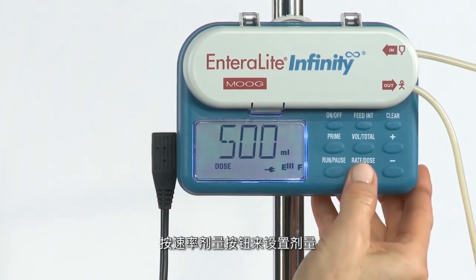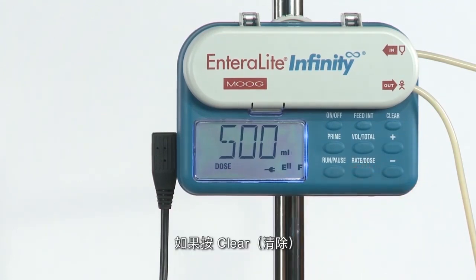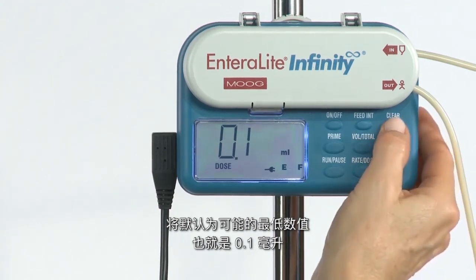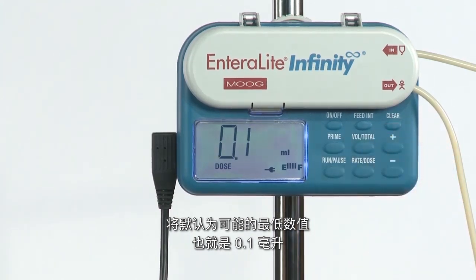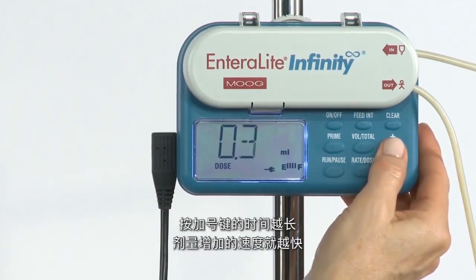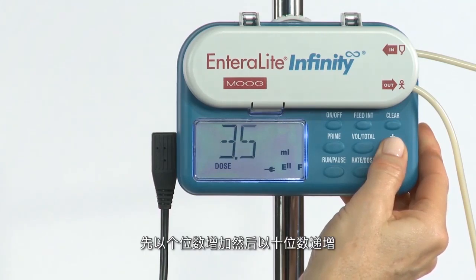Press the rate dose button to set the dose. If clear is pressed, it will default to the lowest possible value, which is 0.1 milliliter. To increase the dose, hold down the plus key. The longer the plus key is pressed, the faster the dose will increase, advancing in single digits and then increments of 10.